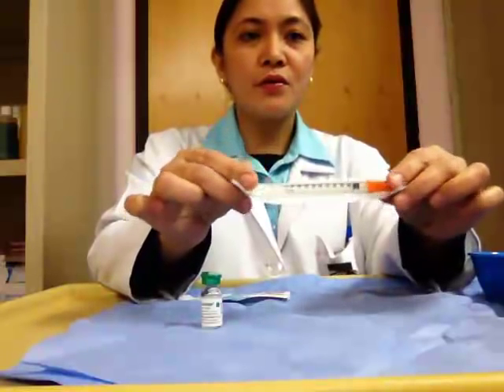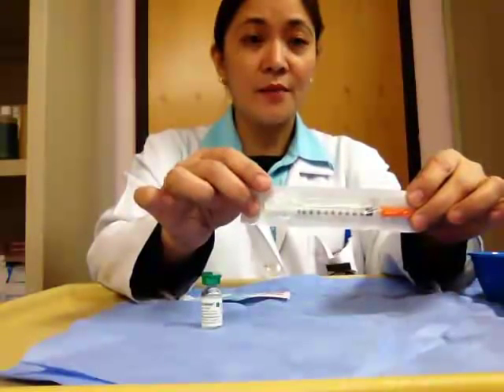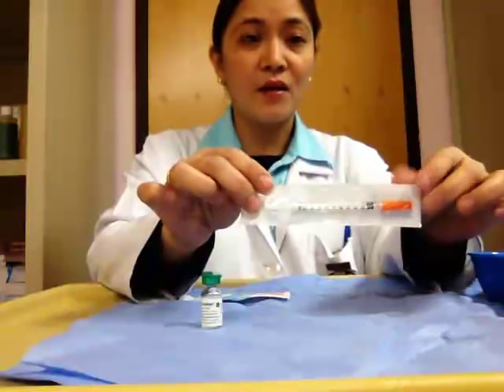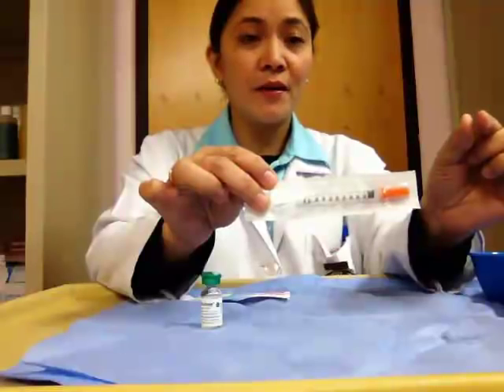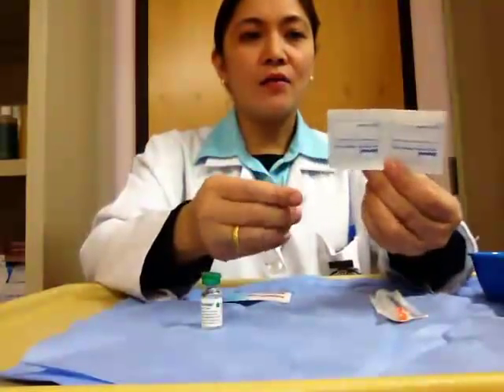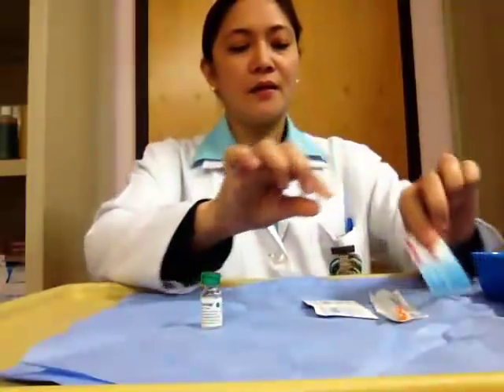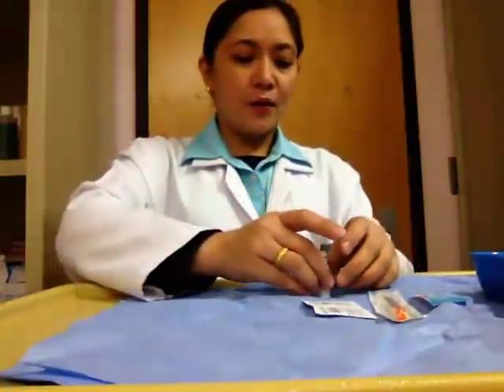You can also use any other 1 ml syringe in giving subcutaneous injection, as long as the needle that you're going to use is gauge 25 or even smaller than that. Of course, we need the alcohol swab and the band-aid that you will apply to the patient's site of injection after. Okay, after thorough hand washing, we prepare this medication and equipment.